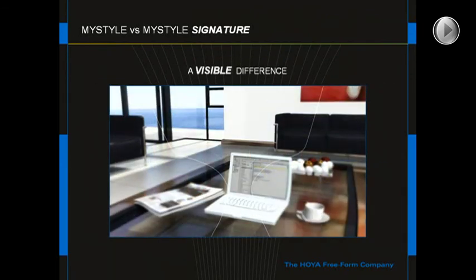And if you can see, there is an outline between those two that will show you a simulation of what the patient can expect, whether or not we personalize this with measured lens positioning values or averaged.